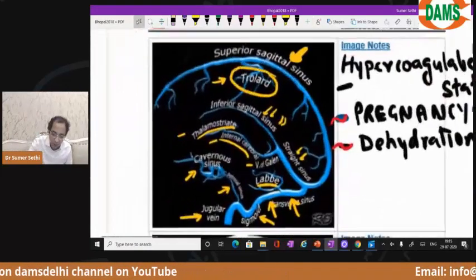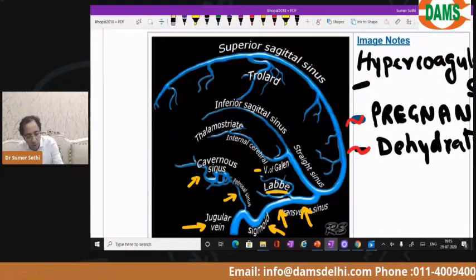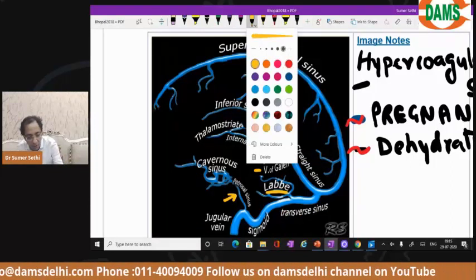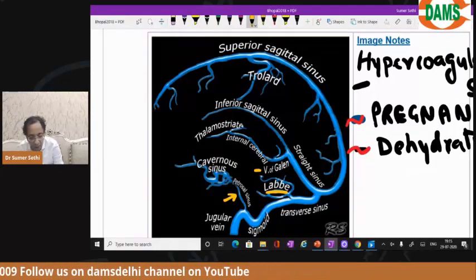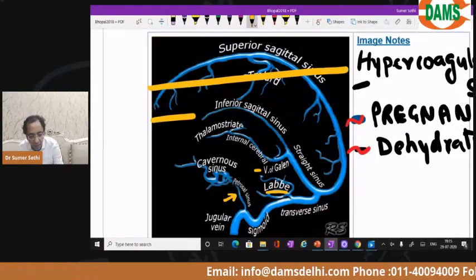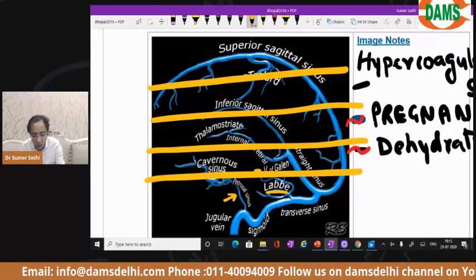Now, let's understand it. The typical sinus that gets thrombosed is the superior sagittal sinus. Let's imagine the superior sagittal sinus. Everybody listen to me. Suppose I take a section here, here, here, here. Look at the first section.